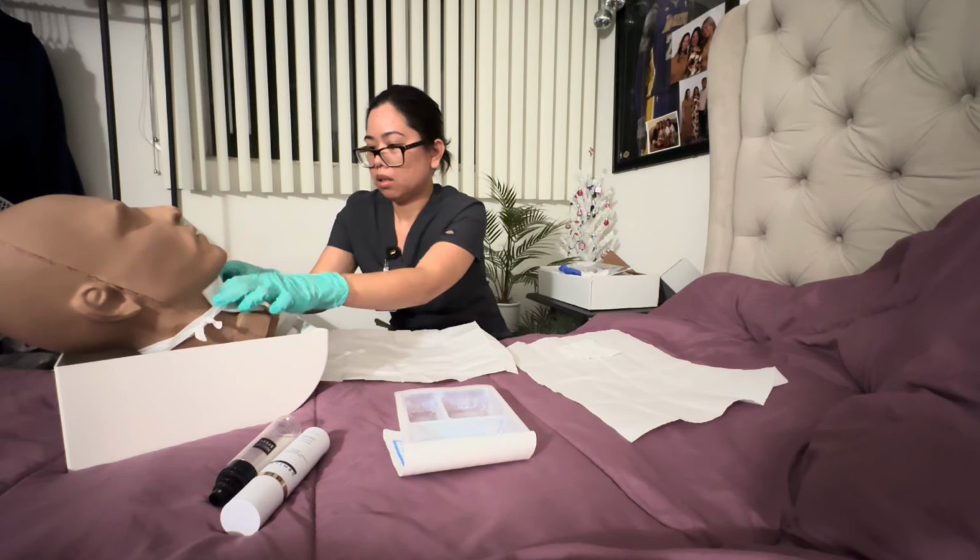Okay, now that's been put, we're gonna also be using a 4x4 gauze, a folded 4x4, and we're gonna put it on the knot area. And this is for the patient's comfort, so he doesn't feel those knots and long ties around this area.